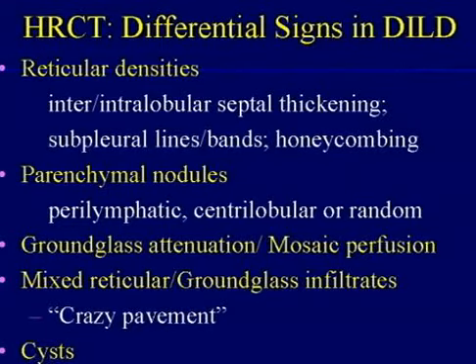as a component of our study. The other advantage of that, and it's one that you probably don't experience mostly yourselves, but I think you can predict in the future will be part of all of our imaging environments, is that if you do all those 1 millimeter thick sections, you now have the capacity to start playing around with CAD systems, because CAD systems, all of them, and I'll have a chance hopefully to demonstrate one of them, are basically based on the notion that the computer is better at looking at 650 or 700 1 millimeter thick sections than we are.